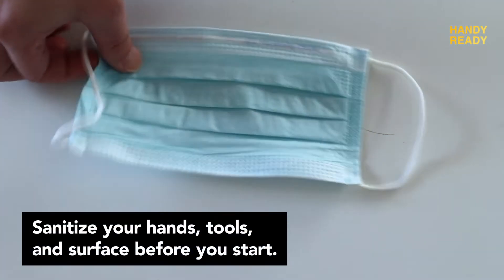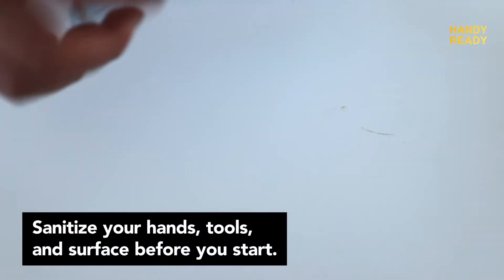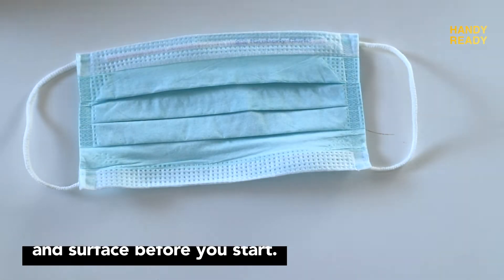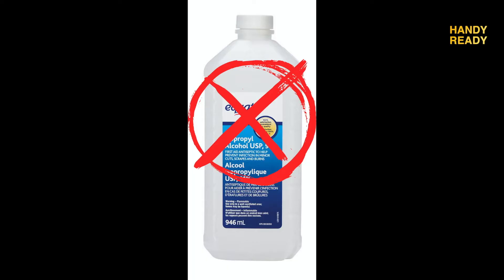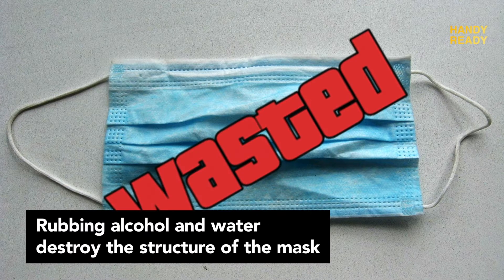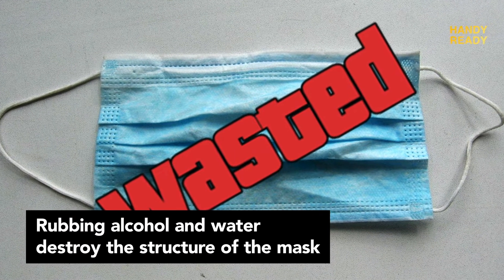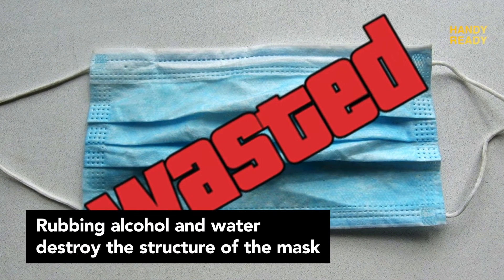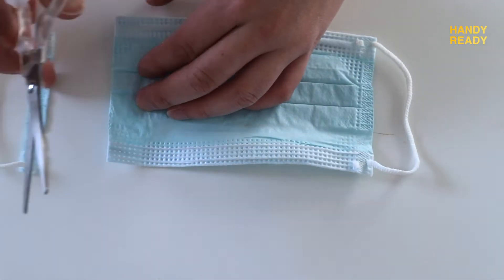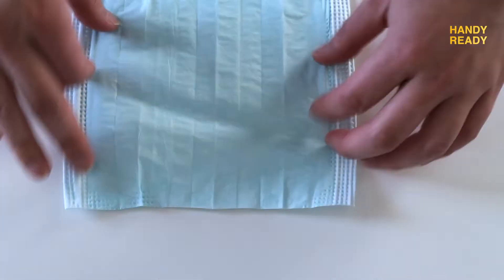The first thing we do is to prepare the filter, which is your mask. Before you do anything, make sure that no alcohol or water touches the mask, or else it will destroy the mask instantly. So no water or rubbing alcohol touches the mask — very important. The first step is to cut the sides and get the maximum area of the mask.